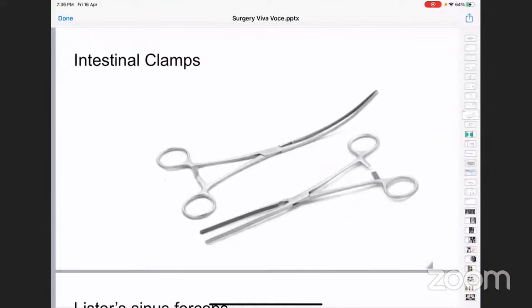A few related instruments that you can look up at this juncture are gastrectomy clamps. The gastric clamps are pretty similar, but slightly smaller in size. And then we have a kind of outdated instrument called the Payr gastric crushing clamp, Payr spelled P-A-Y-R. This was generally used in partial gastrectomies, applied on the side which will be resected as the specimen. Most surgeons do not use it.